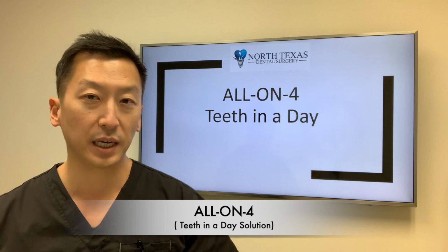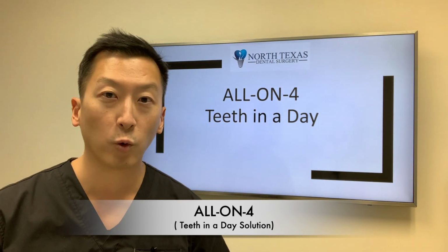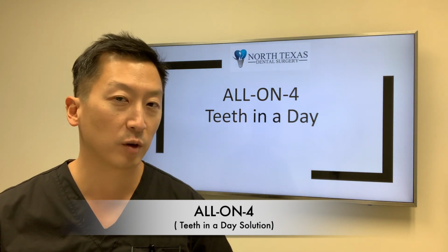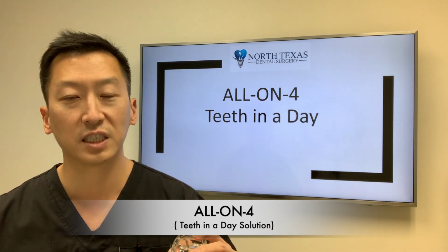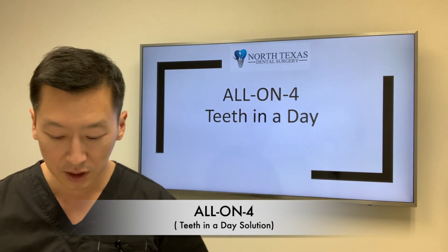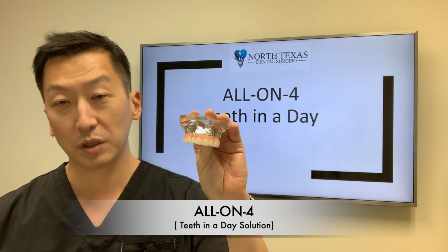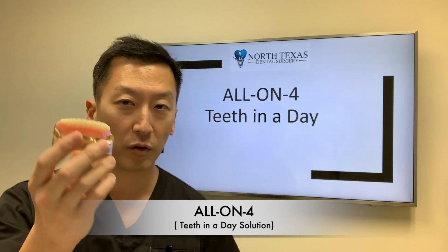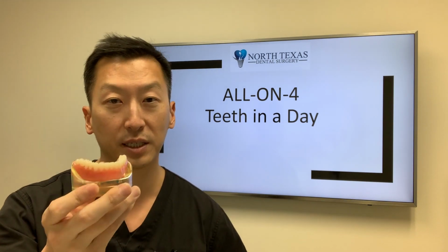I have seen patients who have an all-on-4 solution on one arch and an overdenture on the other arch, and I've heard from those patients that they are way more satisfied with their all-on-4 solution. Another added benefit is that, realistically speaking, the all-on-4 solution is essentially that: it is teeth in a day. The implant-supported overdenture or the snap-on denture often turns out to be a 4 to 5 month process.